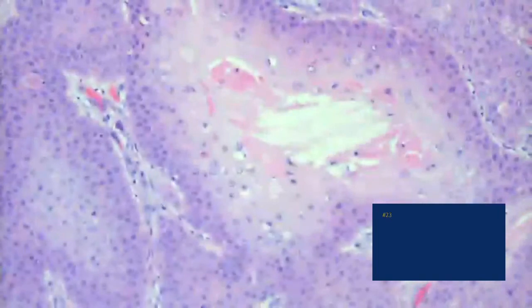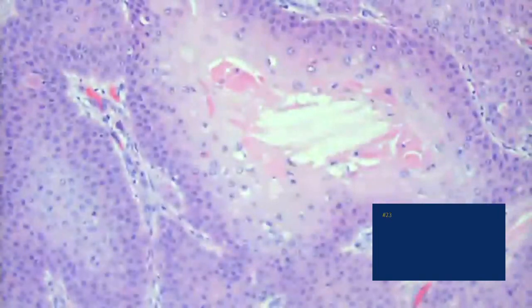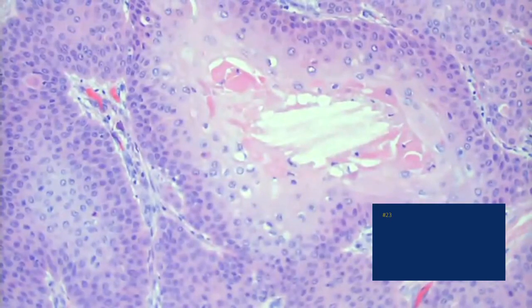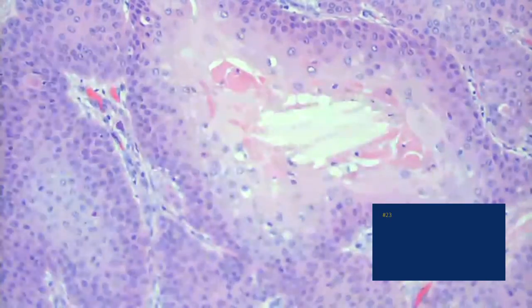So I was like, is this a pilomatricoma or... What if you just had this, a pilar tumor of a sort? Pilar tumor. Okay, you're getting closer. You said the first word before. So probably it's a proliferating pilar tumor. Good. Proliferating pilar tumor, which I couldn't find yesterday night.